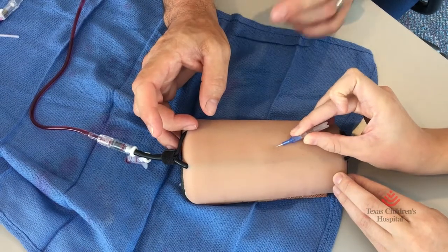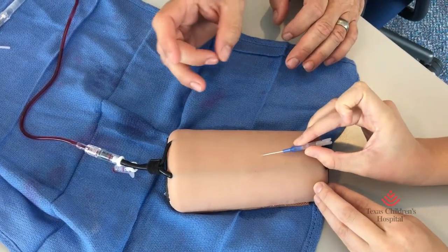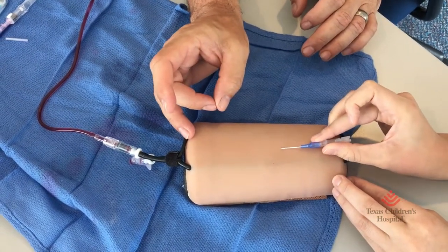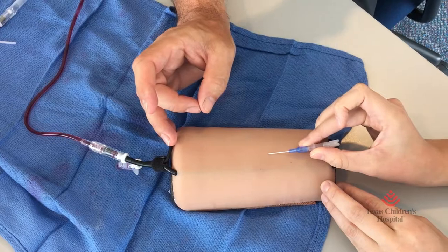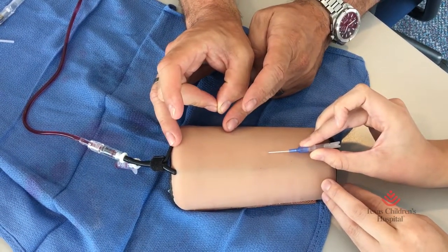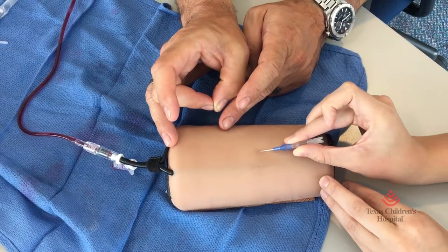Very nicely — that's how you do it, just like that. Your movements to the left and right are going to be almost one millimeter; they're going to be so subtle. Because you've gotten really close when you eyeball the vein and know where you're going. These tiny little adjustments make the biggest difference. There you go.